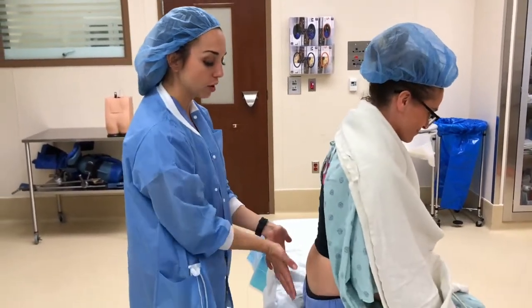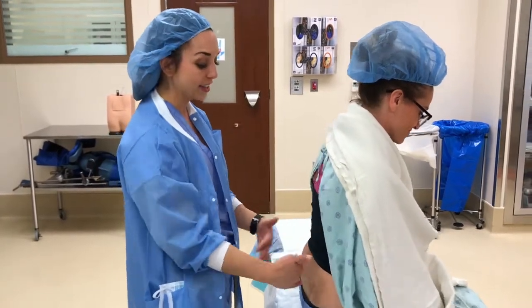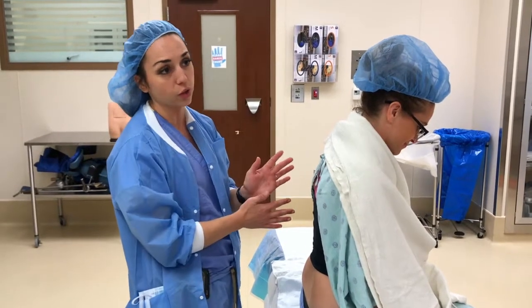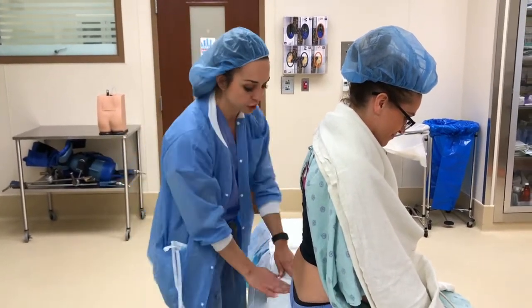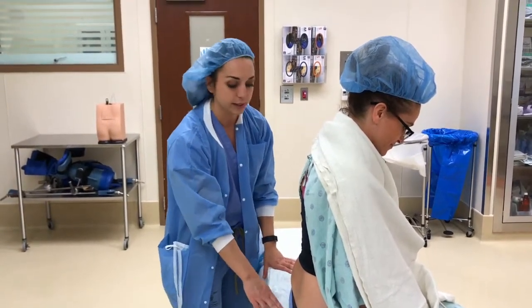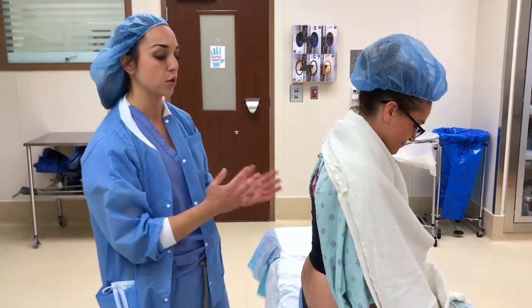Make sure that the hips are aligned. You don't want one hip out of axis with the other hip. Obviously, that will cause a degree of rotation, making it harder to find your midline. Also be wary, there's usually a break in the bed. Just make sure that for this procedure, they're not sitting on the break. Sometimes that can also affect the tilt of the hips or the rotation of the spine.